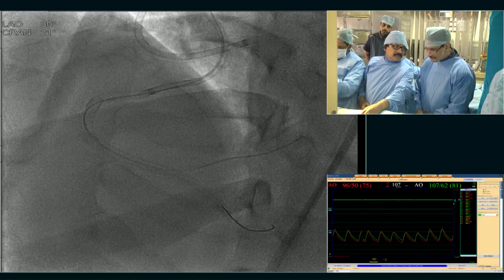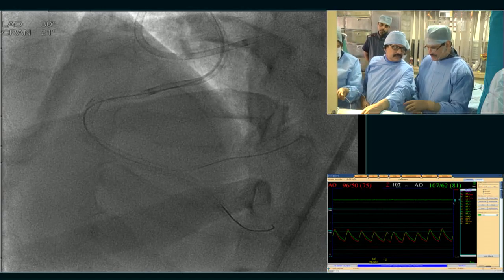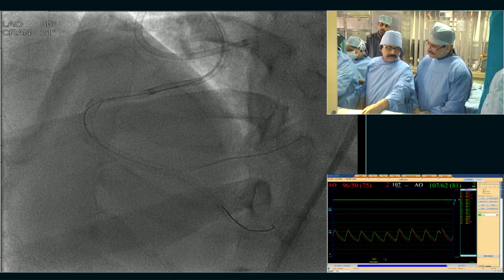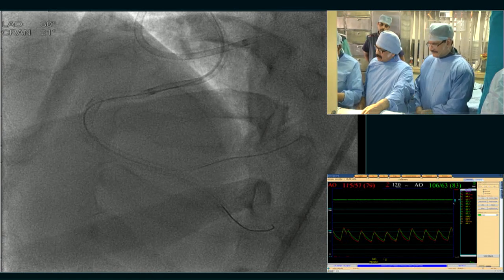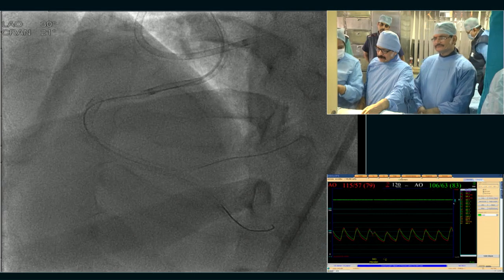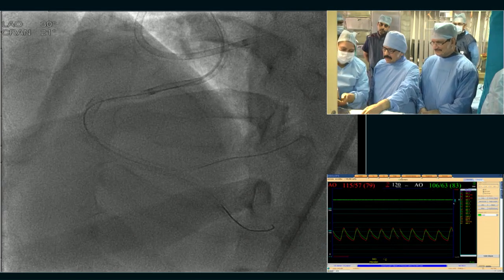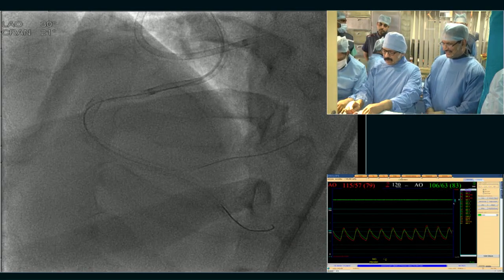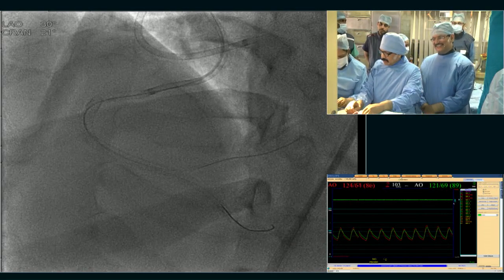Let's take it. We did it with the 3.5 balloon, let's do it again here. Pre-dilated. It is coming, sir, we cannot do anything about that. So everybody is confident about crossing the balloon, 1.5. So far we are optimistic for this tough case, so hopefully, fine.